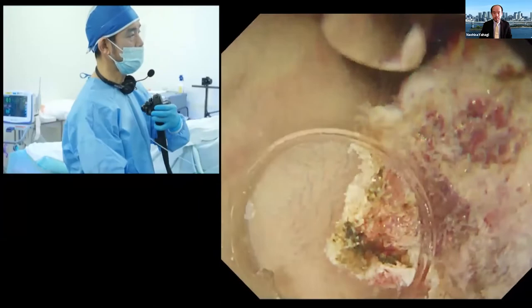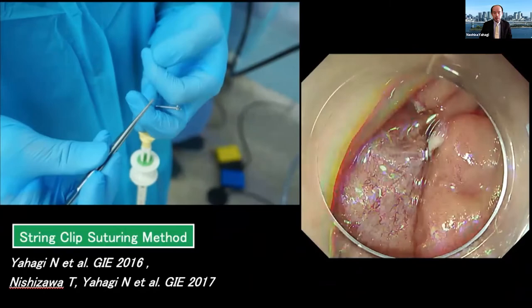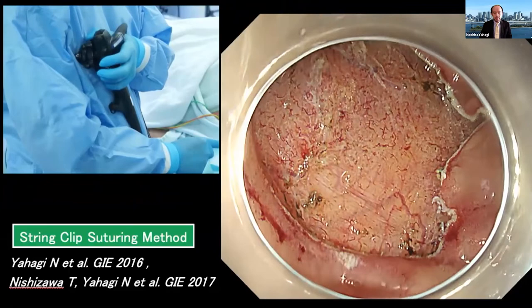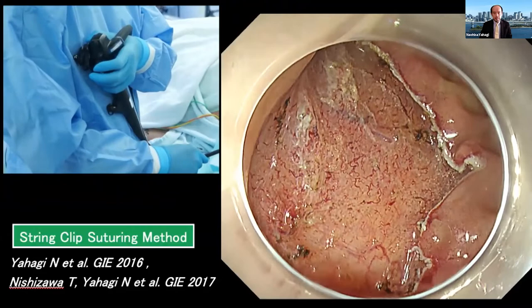My assistant is tying a 4-0 surgical nylon string to the end of a reloadable Olympus endoclip. Now it's ready to use. This is the resection bed. There is no muscle injury at all and I have already coagulated the exposed blood vessels. We can see movement of the outside through the muscle layer, meaning the muscle layer of the duodenum is quite thin. Therefore, it's mandatory to close every large defect after ESD in the duodenum to avoid serious complications such as delayed bleeding and perforation. I'm going to close this large defect using the string clip suturing method, which I originally developed a few years ago.